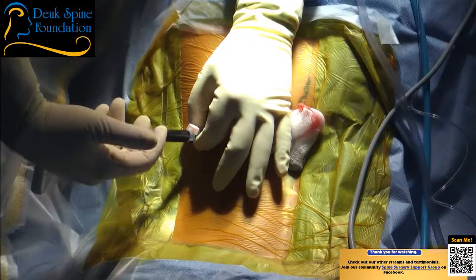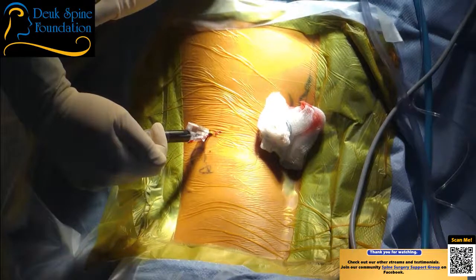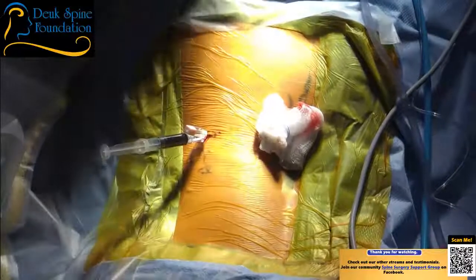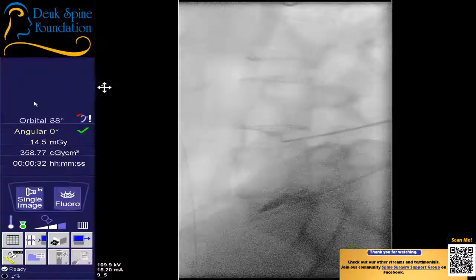Yeah, it's still going to hurt probably for a little while. How bad is that on a scale of 1 to 10? All right, I apologize. We can put you to sleep now. Look at the large tear, folks, on the back of 5-1. Huge amount of dye coming out through the tear. That's where her back pain's coming from, is that annular tear. And that's what we're going to fix.